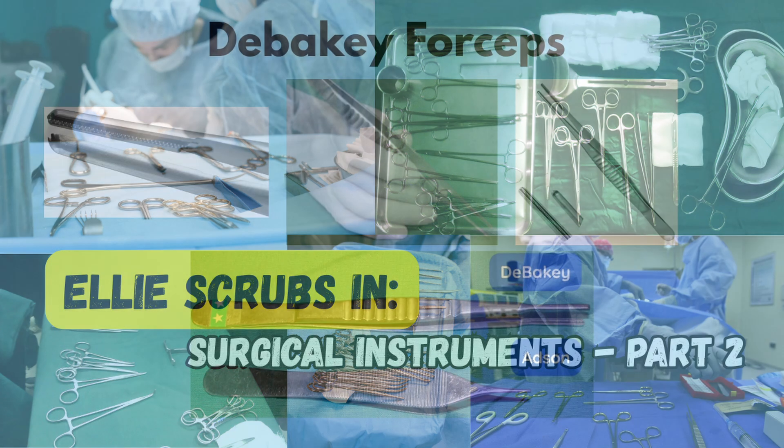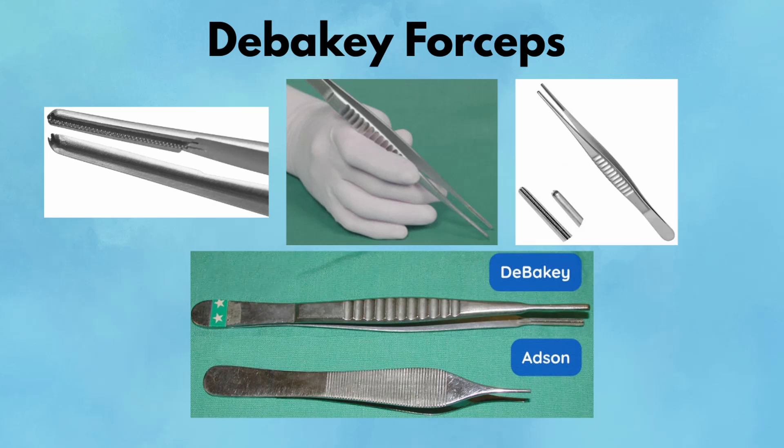DeBakey forceps are a surgical staple, known for their fine, atraumatic ridges. They're designed for handling soft tissue without crushing. You'll use them when working around vessels, bowel, or anything delicate. Their interdigitating pattern grips securely but won't tear fragile tissue. These forceps come in various lengths and are used from superficial dissections all the way down to deep pelvic work. When a surgeon asks for pickups during vascular or bowel dissection, they mean DeBakeys.